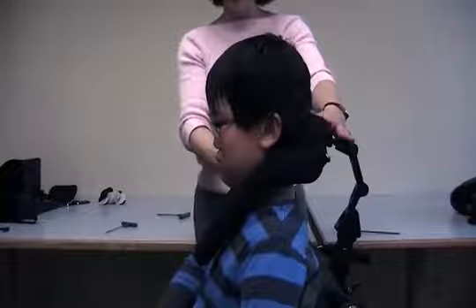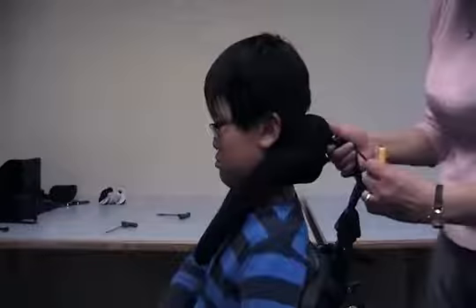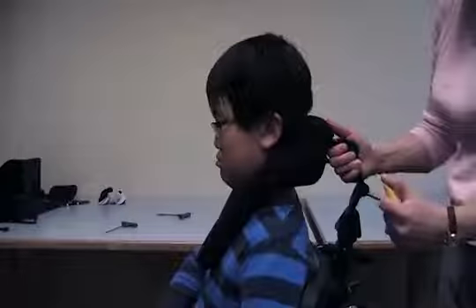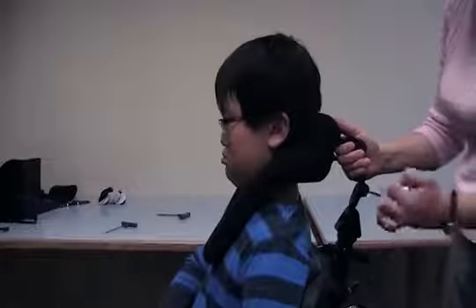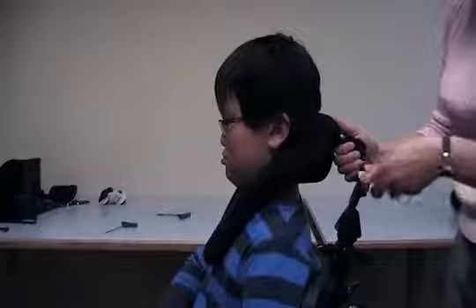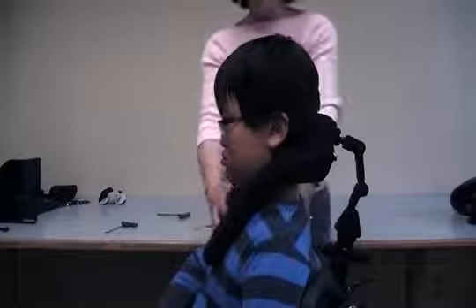It looks here as if the client might be pushed just a little bit forward, so let's move this back just a little bit. We can see that we now have a little more neutral presentation.